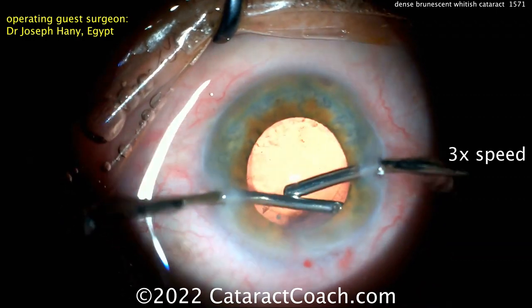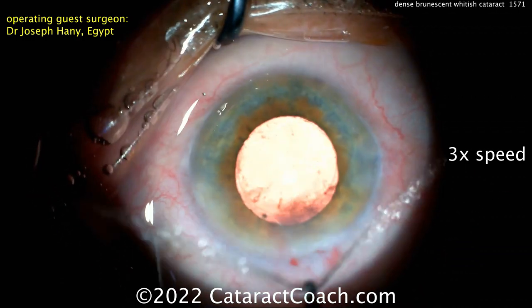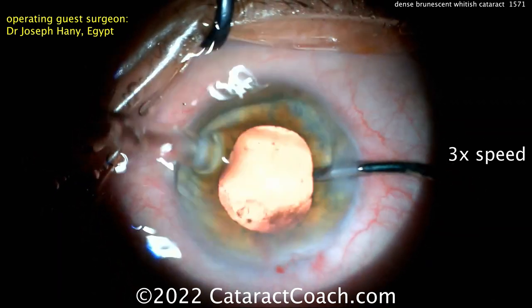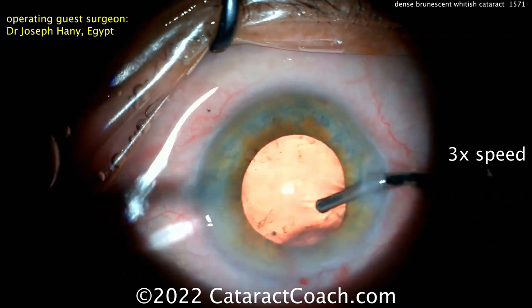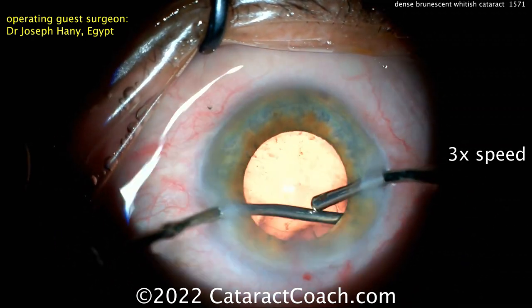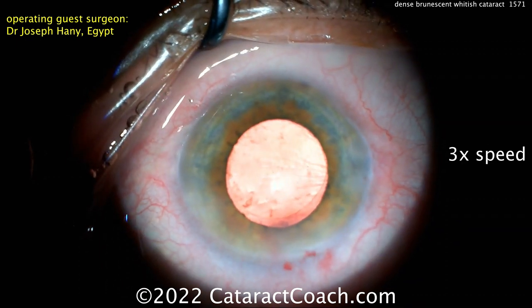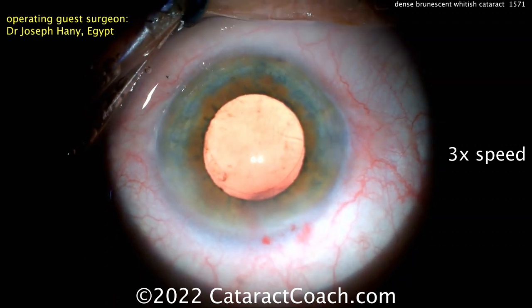Certainly get that superior cortex — if you leave any of it, it'll swell up overnight and fall under the patient's visual axis. A little bit more cleanup there. Irrigating with the right hand and aspirating with the left, cleaning up that superior cortex. Look at that big piece of cortex — smart move, doctor, you found that piece. I couldn't even see it so well in the video, so I applaud you for that one.